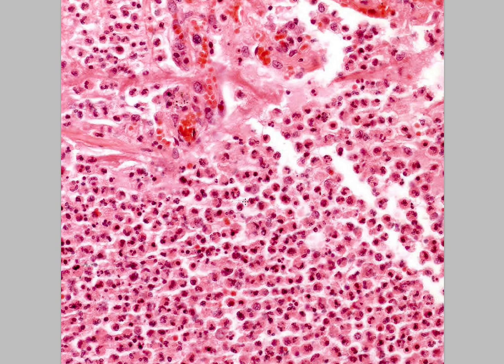If you look around a little bit, you might see a couple of segmented nuclei. All of these are essentially inflammatory cells, and you can see plenty of examples of the Mickey Mouse nuclei. Of course, there might be a couple of smooth, round nuclei, but I don't see a whole lot. I think it's mostly the segmented kind. So this would be a good example of acute inflammation. And this is actually a sample from a lung. This would be acute lobar pneumonia.